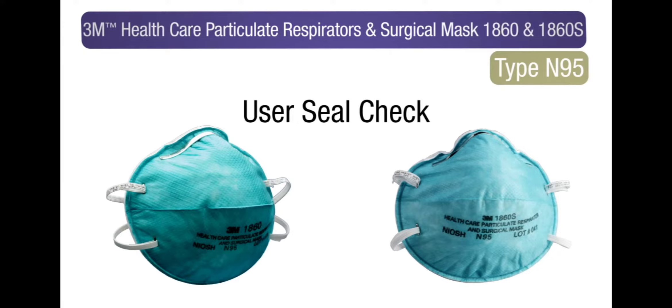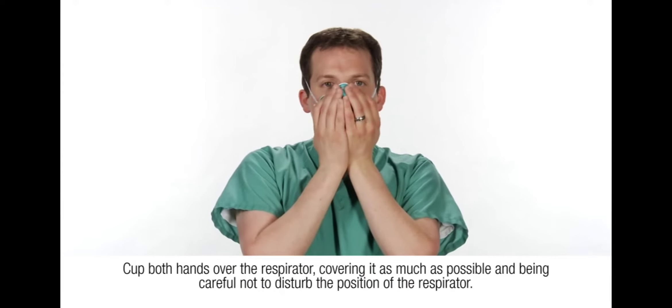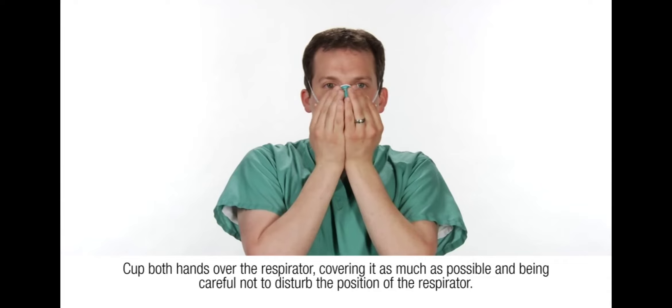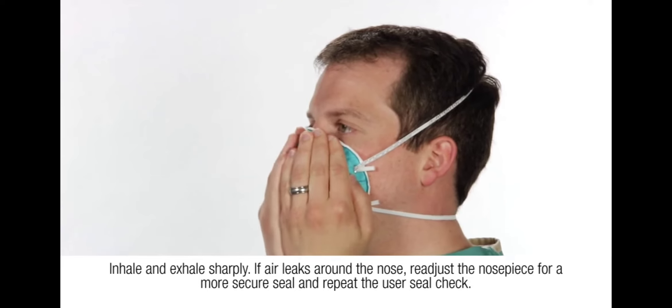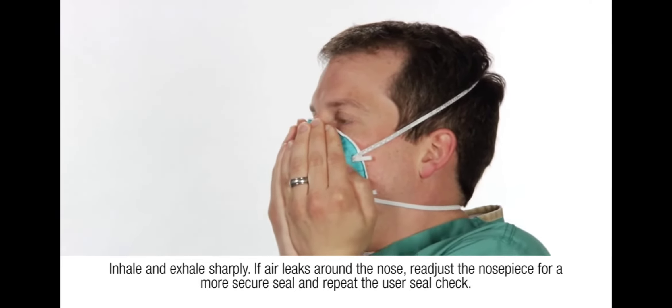Perform the following user seal check each time the respirator is put on. Cup both hands over the respirator, covering it as much as possible and being careful not to disturb the position of the respirator. Inhale and exhale sharply. If air leaks around the nose, re-adjust the nose piece for a more secure seal and repeat the user seal check.